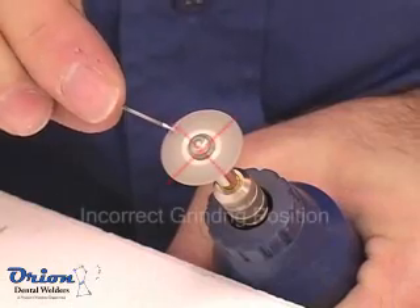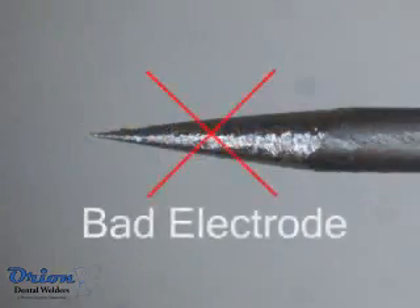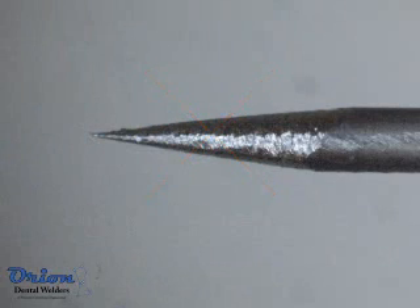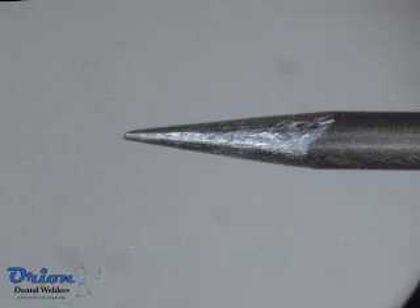Do not grind the electrode so that circular grinding marks show up on the tip. This will cause the arc to wander and will make welding more difficult. When the grinding marks run parallel to the shaft, the arc is stable and repeatable.